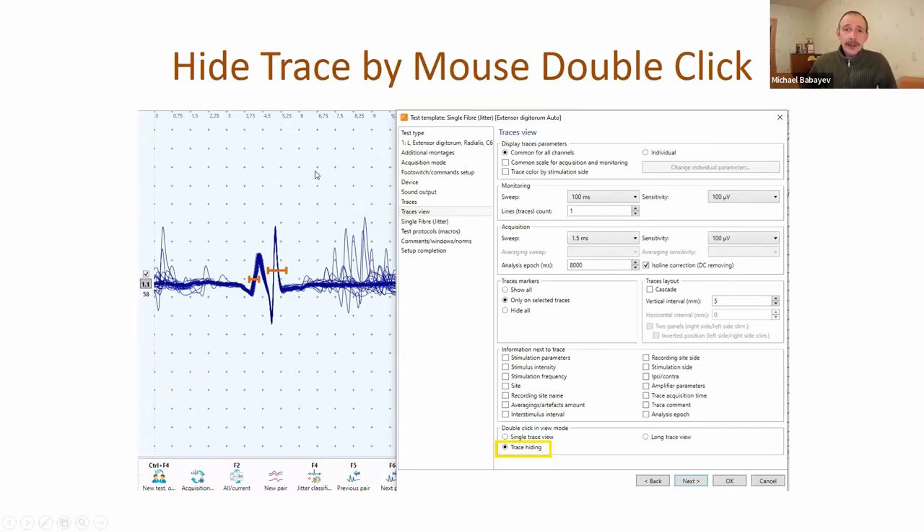Now it's possible to hide a trace by mouse double-click - there is a special setting inside the test template. For example, in the jitter test you can see single fiber action potentials, but also some other action potentials that some doctors would like to remove. You can make a few mouse clicks to remove them from analysis, or use the measuring rectangle to drag and select all these traces and then hide or delete them.